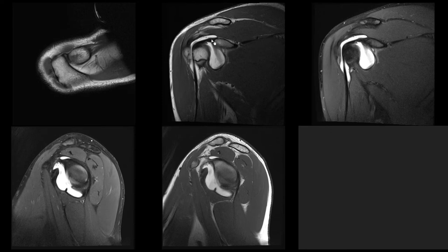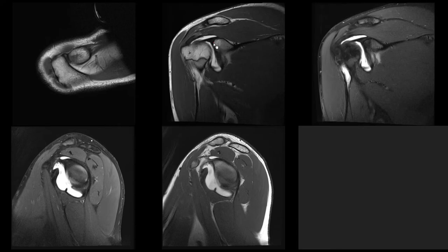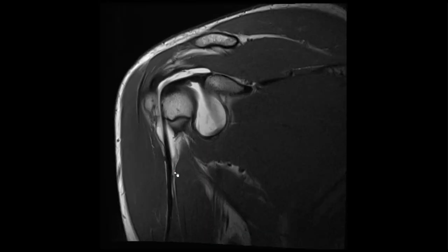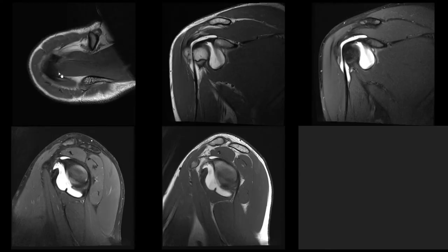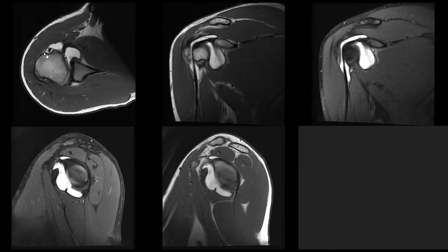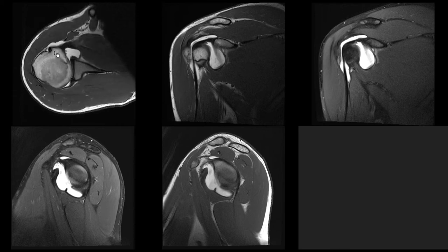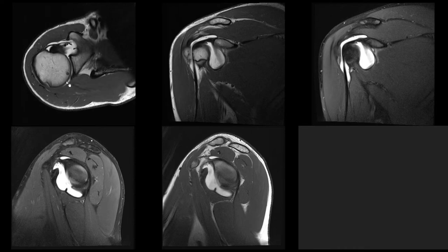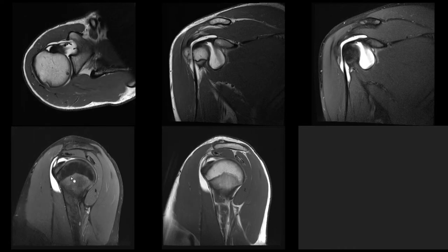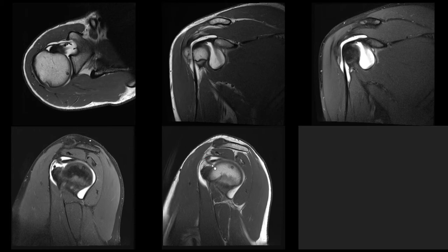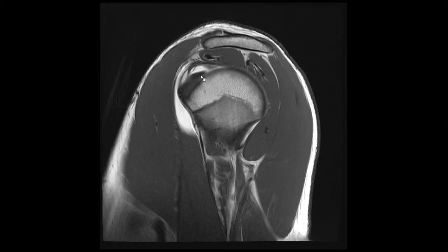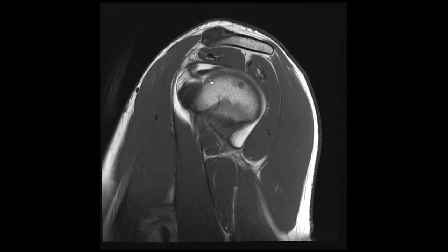Then the next thing is the long biceps tendon. Make sure you start off with the origin here and then you can follow its course nicely down into the bicipital groove. Check it on all your available sequences — it's nicely central here in the canal so it's not subluxated. And also here you can see the biceps pulley, which is a little bit thickened, but the tendon itself, position-wise, is okay.